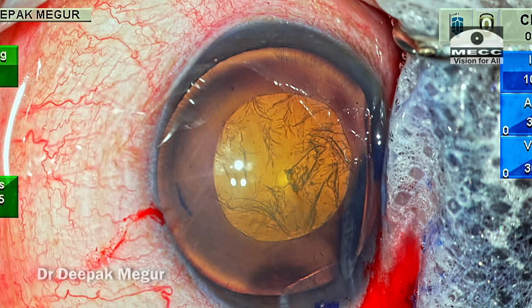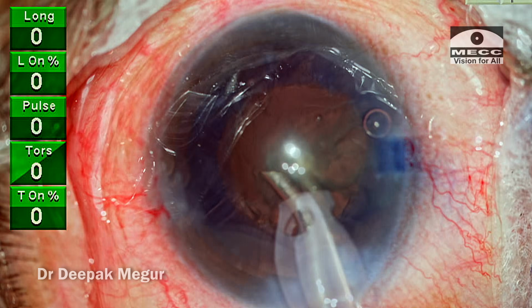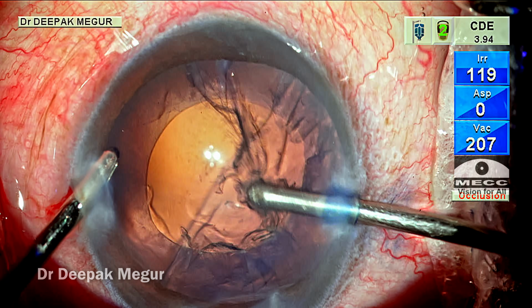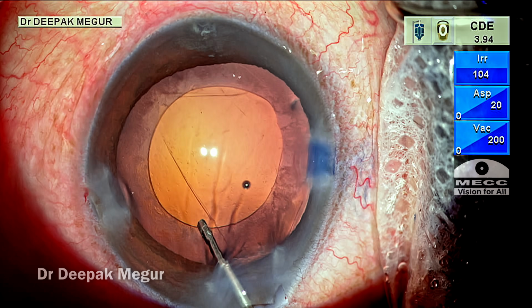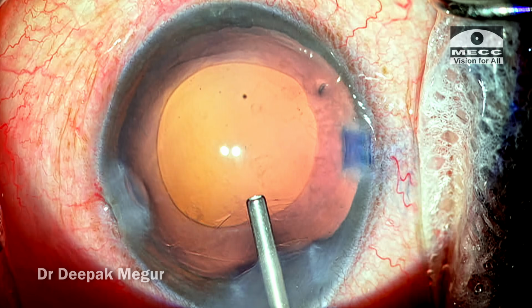This is an eye which is a primary angle closure suspect who has undergone iridotomy. The phacoemulsification was uneventful and I'm just getting ready to place the lens into the bag. You can see this rhexis is perfectly fine. It's appropriately sized and well centered, circular.